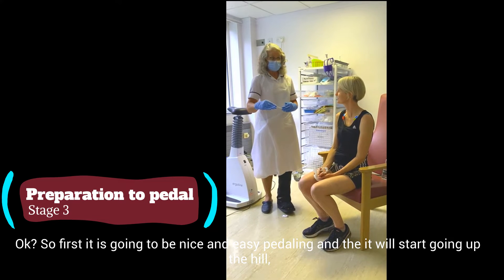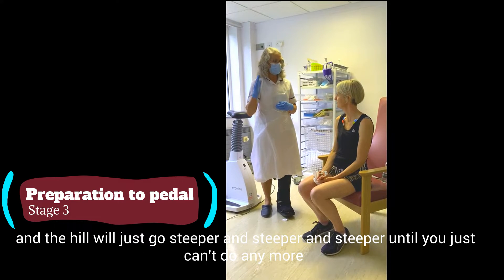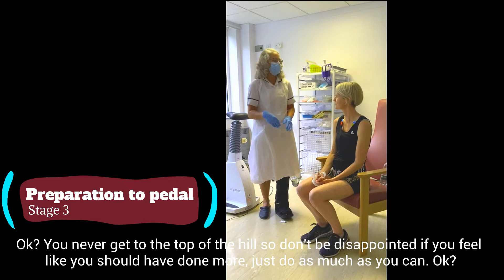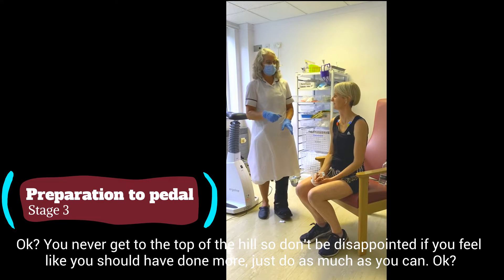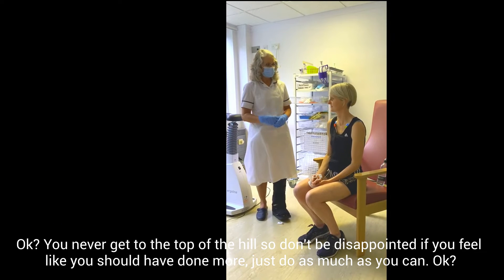So at first it's going to be nice and easy pedalling, and then it'll start to go up a hill. And the hill will just go steeper and steeper and steeper until you just can't do any more. You never get to the top of the hill, so don't be disappointed if you feel like you should have done more. Just do as much as you can.